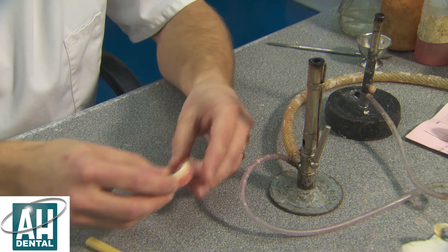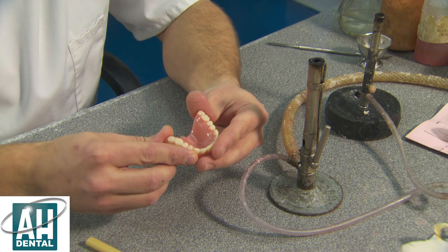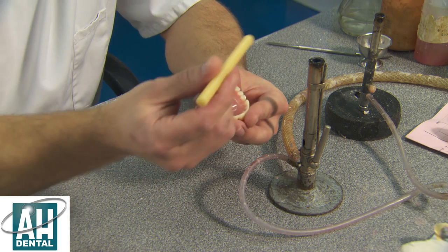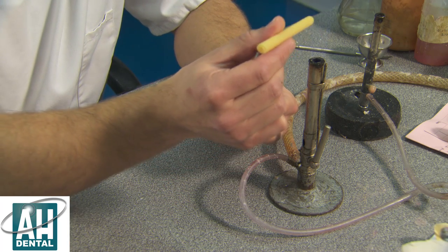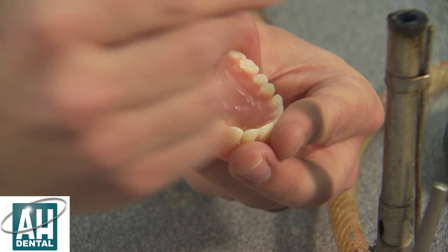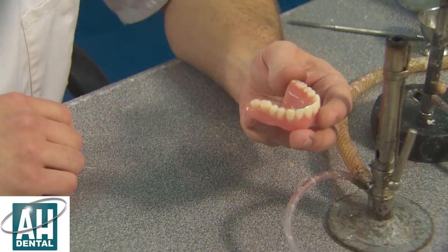We've got the two halves of the denture and we're going to locate them together. We're going to use this special wax with a couple of blobs in the palette just to hold it together, so it's now set.